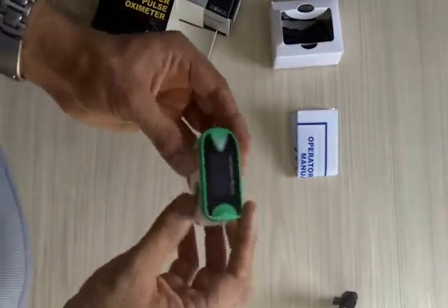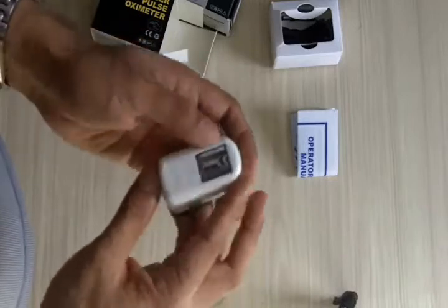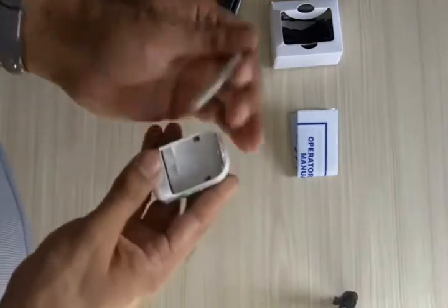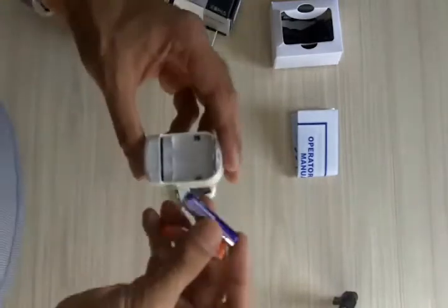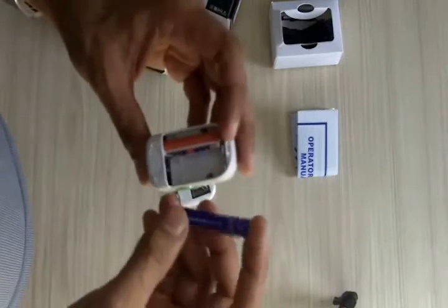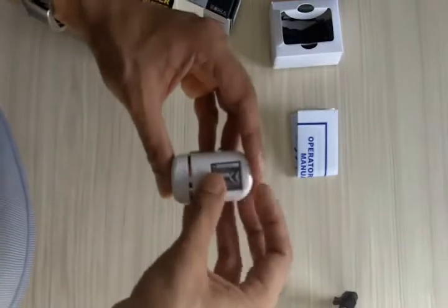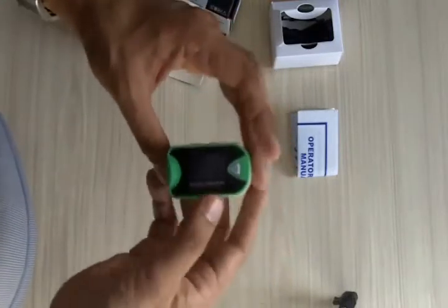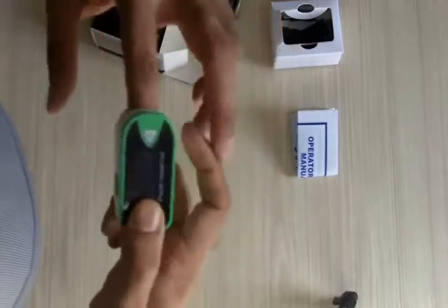This pulse oximeter works with two batteries which can be put in on the backside like this. These are AAA batteries, and once you put them in, all you have to do is close the pulse oximeter and that's it — you're ready to use it.